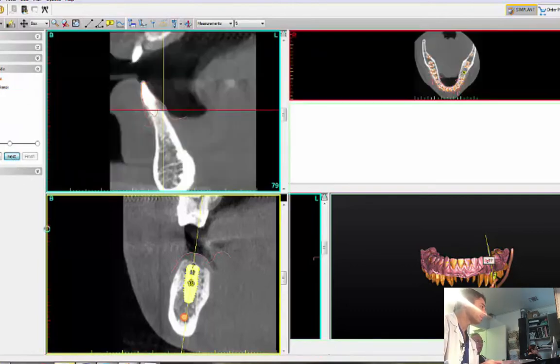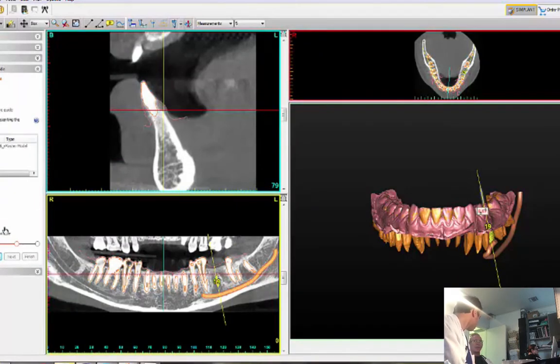Do you think, when you're not doing a great number of implants, that getting involved in guided surgery and committing to one system is better? There are some systems where you can use proprietary drills and then the finishing drill is set for the company. That's what I did when I did my first case. I don't like that. It's a headache, but it works. I did a fair number of cases where I needed to take parts from here and parts from there, and it worked. It's better to go the whole system for me.